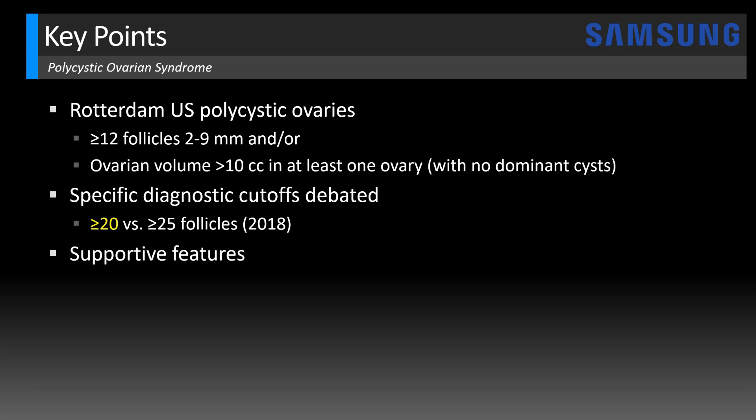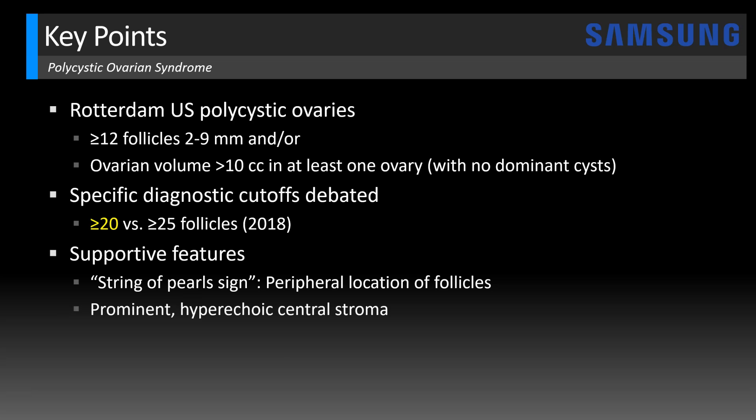Other supportive features, as we saw in this case, would be that string of pearls sign where you have the peripheral distribution of these follicles instead of randomly scattered throughout the ovary. And that usually is accompanied by this prominent central stroma, which may be echogenic or hyperechoic.